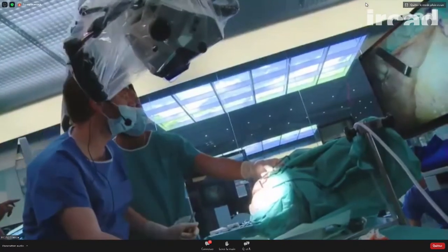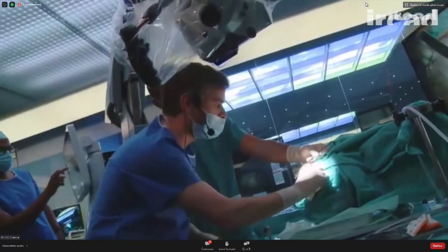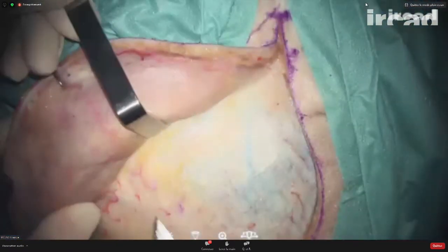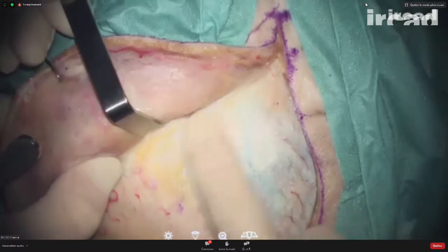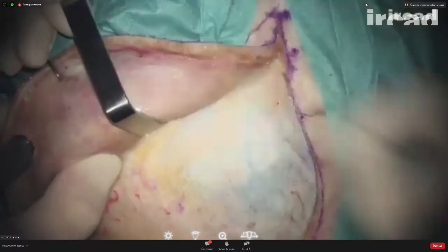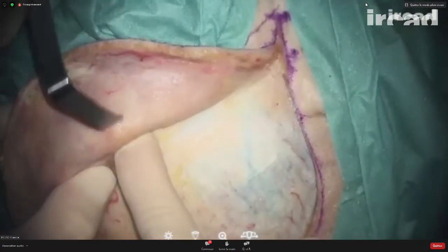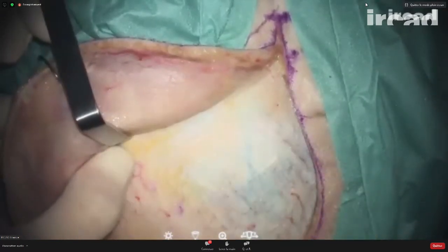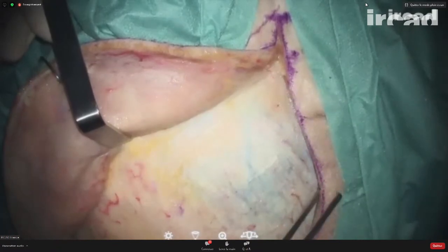And it's time now to lower the light a little bit, to start interfascial dissection at this point. Because if I keep going into this plane here, I will find the frontal branch of the facial nerve. So here I feel the area of the keyhole. So now it's time to start the interfascial dissection.